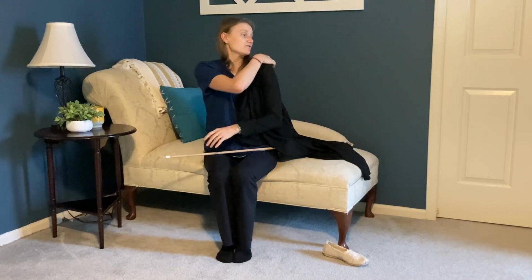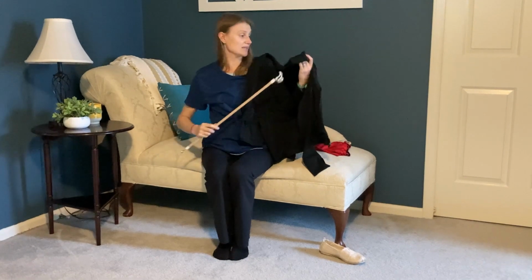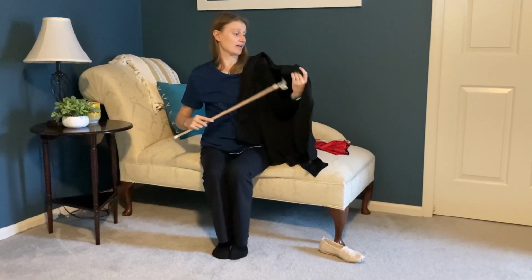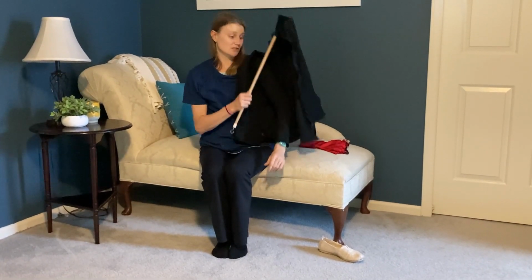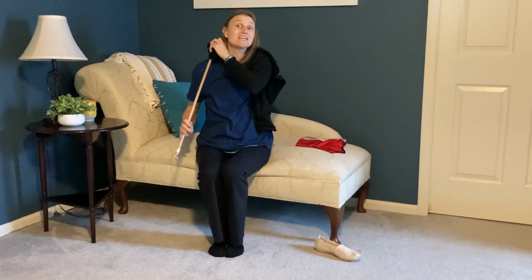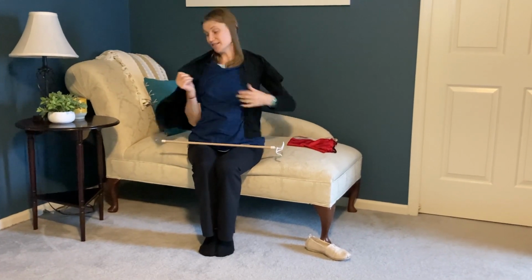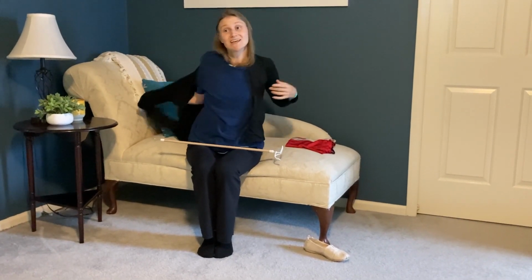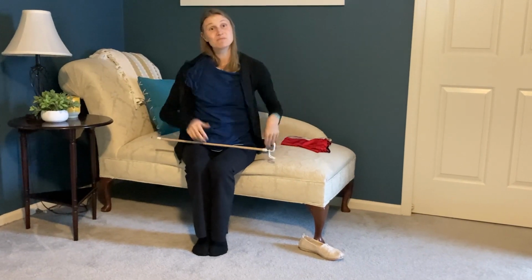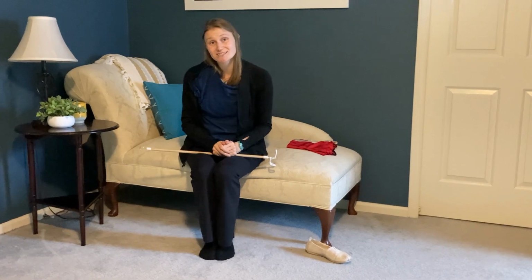And if I have difficulty reaching up and over to the other side, I can take the side or the neckline of my sweater, hook it onto the dressing stick, and then use this to kind of swing it up and around until I can reach it on the other side, unhook it, and then I can swing this back around to get my arm in the sleeve, and then I was able to get on my jacket and my sweater.